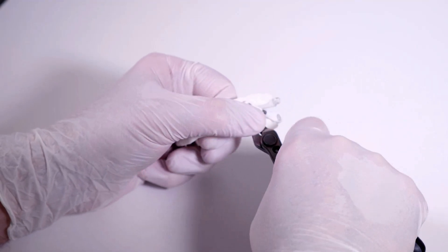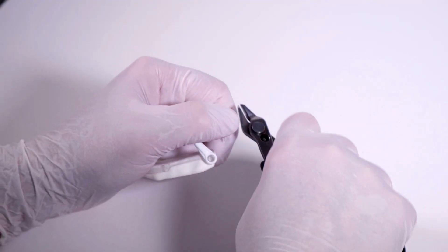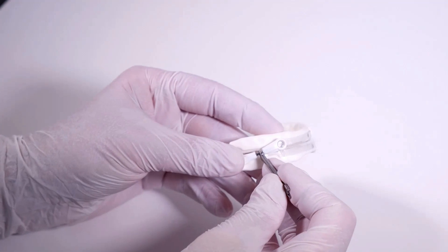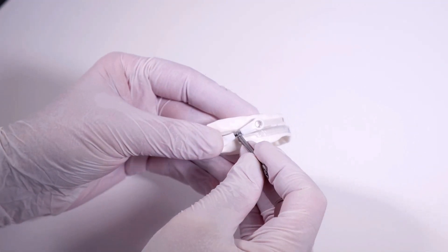The four unused fixation knobs can be removed with a side cutter. The extent of the lower jaw advancement depends upon the length of the connectors. The shorter the connectors, the larger the lower jaw advancement.